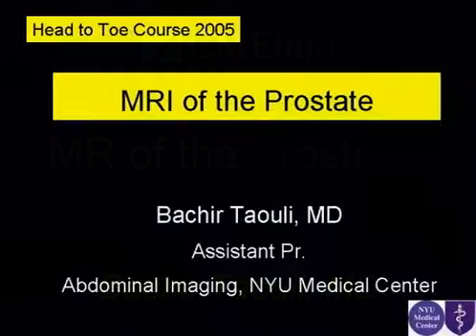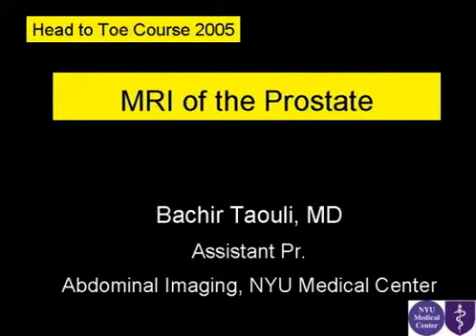So this will be an overview about the state-of-the-art MR imaging of the prostate. This includes conventional MRI and spectroscopy. I'm going to speak a little bit about contrast-enhanced MRI and diffusion-weighted imaging also of the prostate.